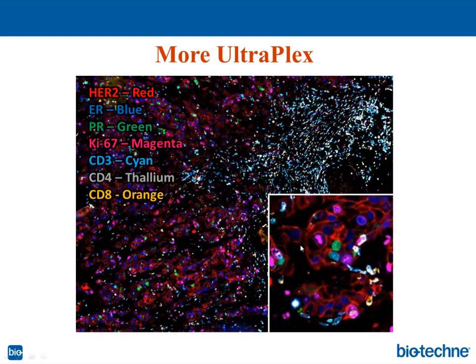Images can be collected as black and white and then pseudo-colored. Then both stainings from slides 1 and 2 can be merged together, and that gives this somewhat messy image, but if we talk about multiple colors, they are all here. So this technique is also available to researchers to do multicolor fluorescence.